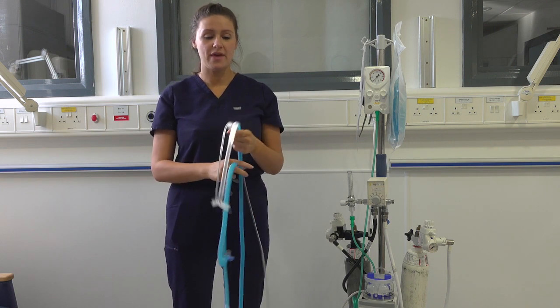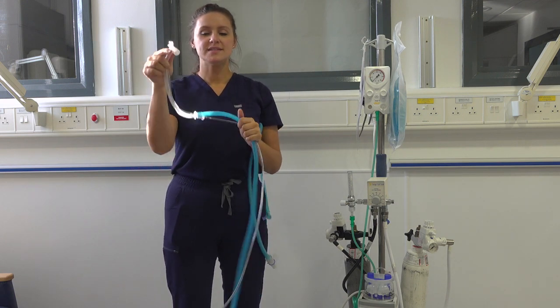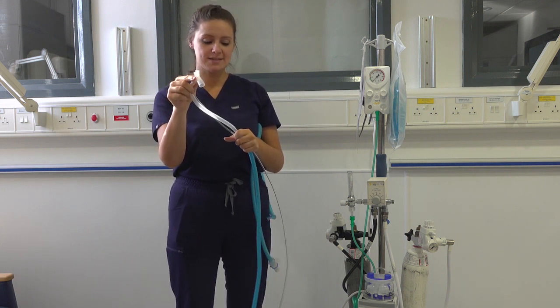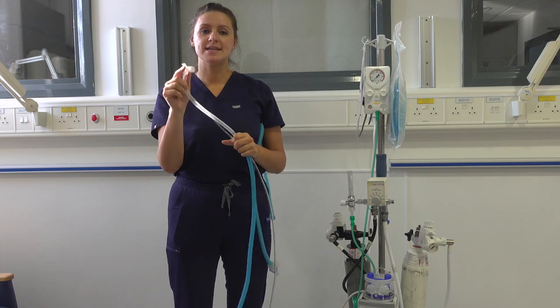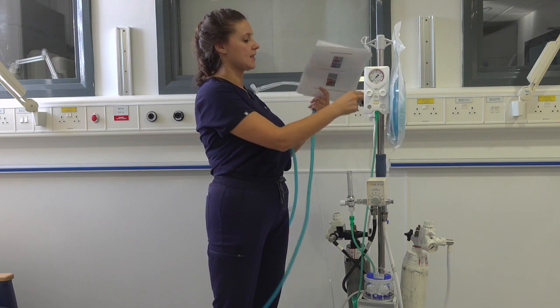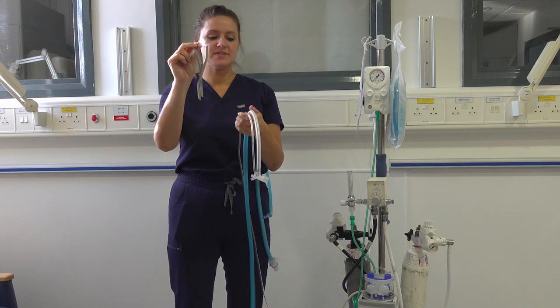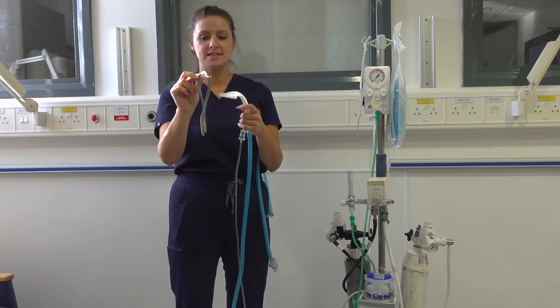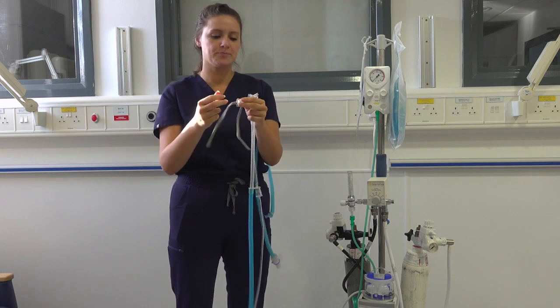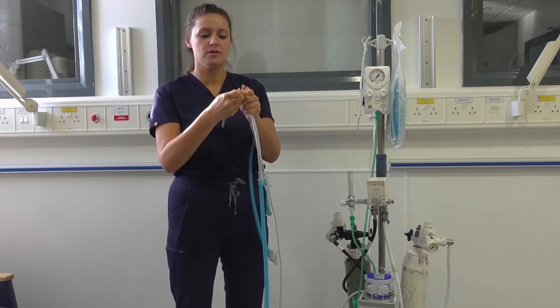So if we start off with the rPAP circuit, this end connects to your baby's ET tube, mask, face mask, or nasal CPAP mask. Hats and nasal CPAP mask can be found in store too. This end facilitates attachment of the nasal CPAP mask, and to connect this, take off this end and place this connector on like so.